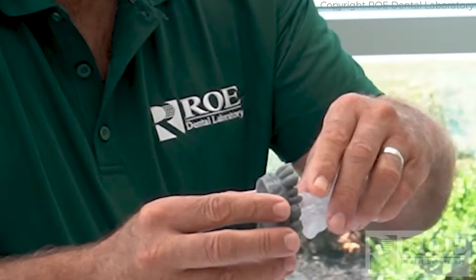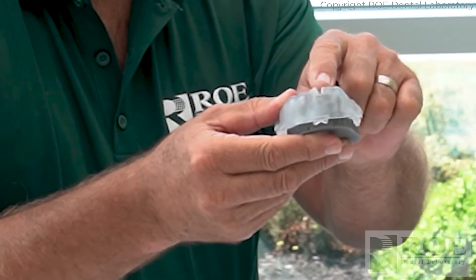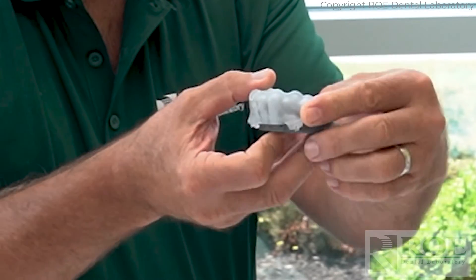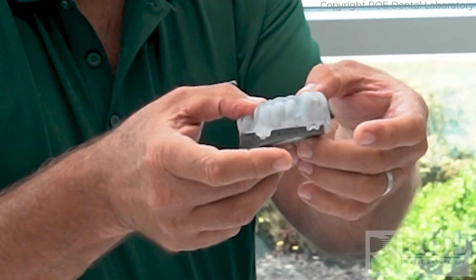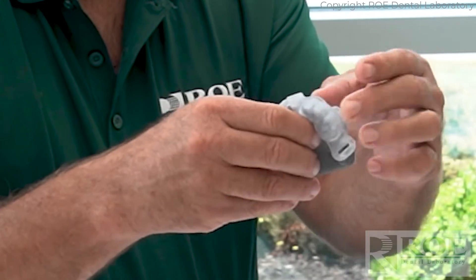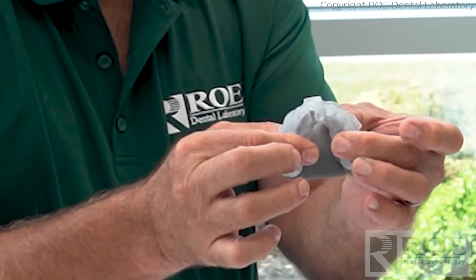Step one with every Chrome case: try to pin the guide in. The pin guide is going to go in the patient. Make sure you can see the windows seated, the teeth, the incisal edges of the teeth seated, the buccal cusps on either side — it's seated. Very important that the guide is held tight.